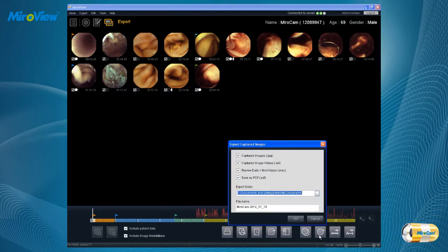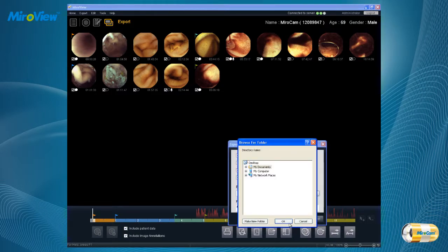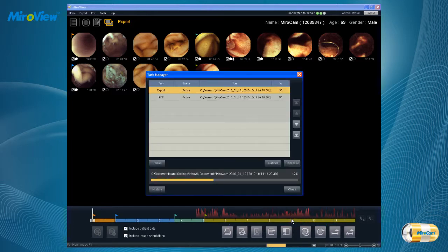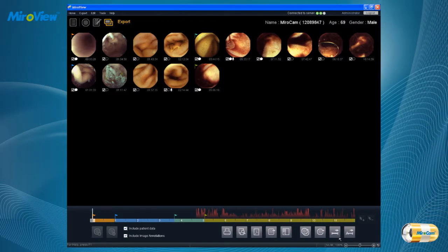Click on the Export Captured Images icon to export captured images as image, video, or MiroView format. A window will appear — select the file type to export, change the desired file location in the selected folder, and click the OK button. A window will appear with a progress bar. Click on the Export Segment icon to export a segment as video or MiroView. Select the segments on the time bar to export.